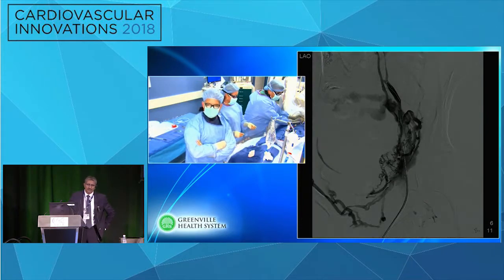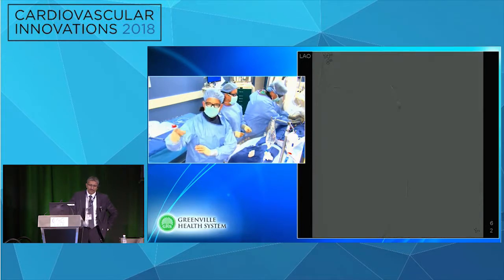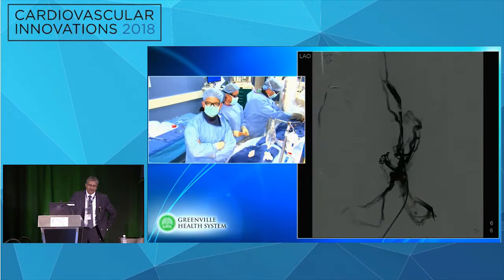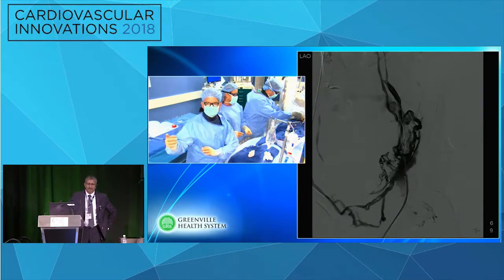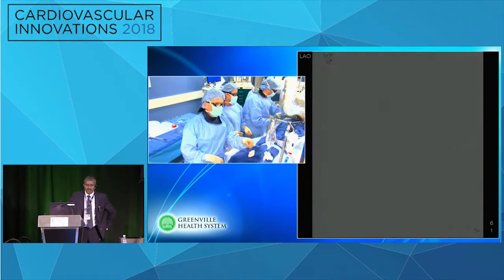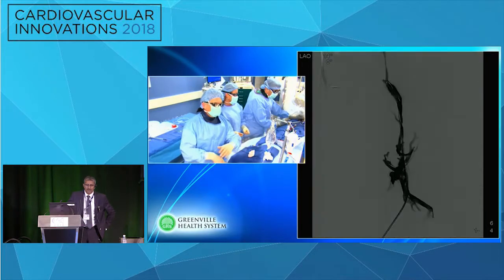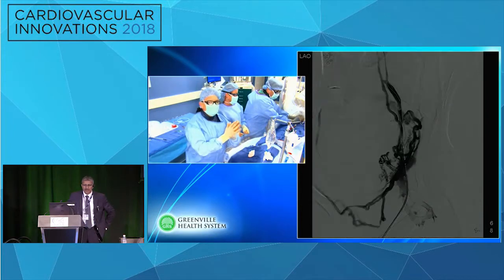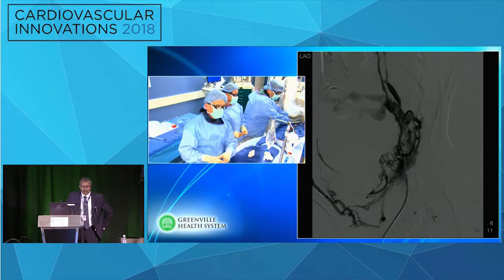So our next strategy now is to access the profunda femoral vein or lower and see if we can come up through the common femoral vein into the external iliac vein more specifically. The other strategy is to pull this sheath way back and see if we can course more medially from the end of where our pre-existing stent is right now. This is a 5 French sheath in the left groin, and we're going to try a second access point and see if we can use what we have in there already as a reference point to then deviate elsewhere. All right, questions?